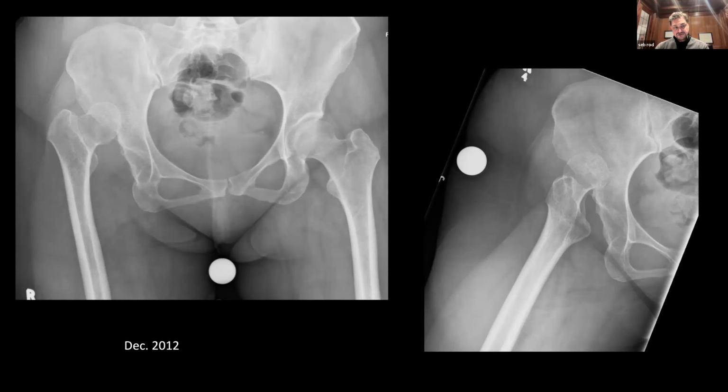Personally, I do a subtrochanteric osteotomy through the anterior approach through a subvastus window. And in these cases, I've found that though I was taught to use an SROM, the Wagner cone actually works pretty well. You can ream through your osteotomy and get good fixation of that distal aspect of the Wagner cone, and then unitize everything. And like Raj, I use a napkin ring on that.